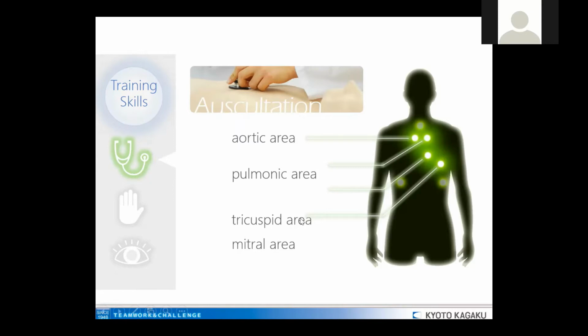And the reason is because with a speaker, we managed to reproduce the sound spreading all over the thorax in the same way that it does in the human body. And that cannot be done with a simulator that works with sensors. So this is also one very important feature. The spread of the sounds is realistic.